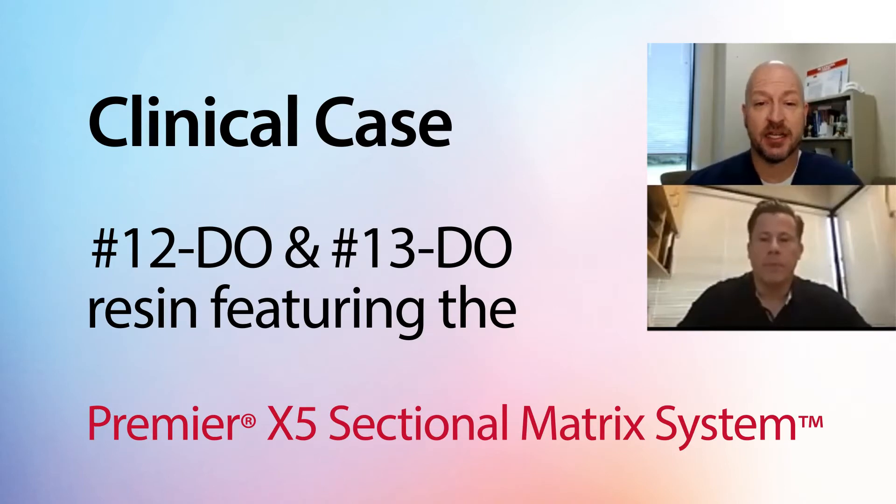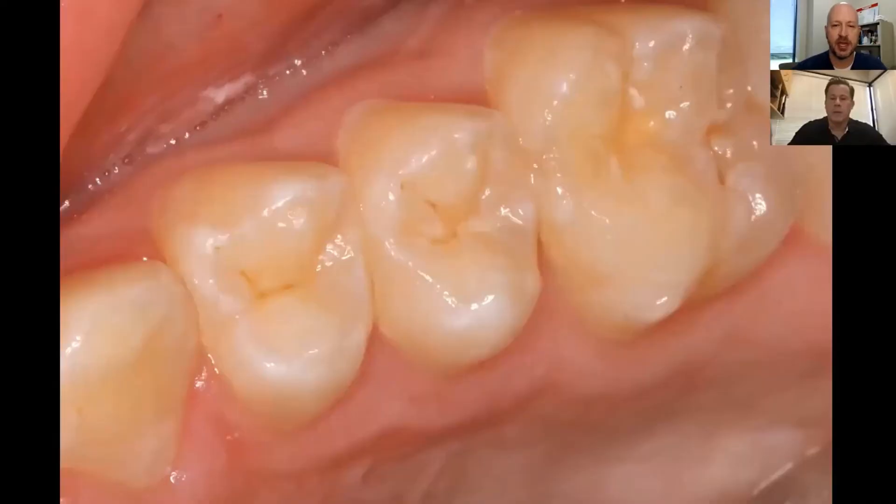Today we're looking at a clinical case: number 12 DO and number 13 DO resins, featuring the X5 system. Troy, what are the techniques, tools, and materials you use to make your class twos easy and efficient and end up with that perfect outcome? Looking at the pre-op situation — pretty common here, number 12, number 13 DO. When you see the post-op radiograph, you'll see that we were able to make nice small preparations. Should we jump in and look at the preparations themselves? Yeah, let's get started.